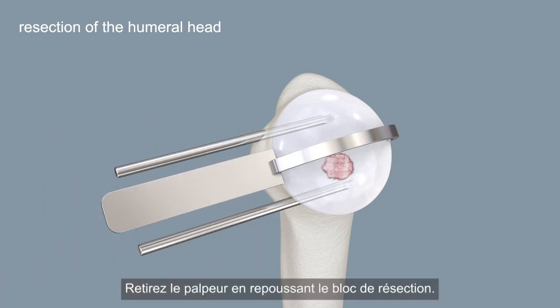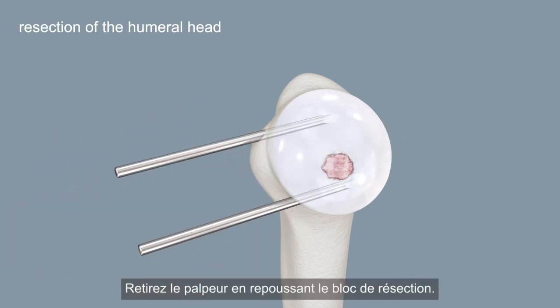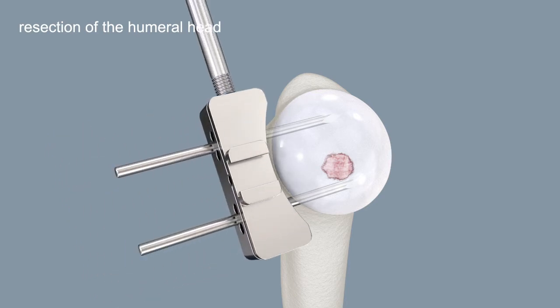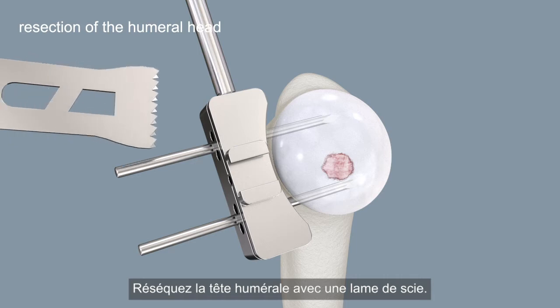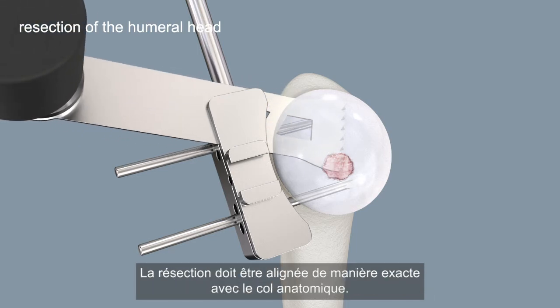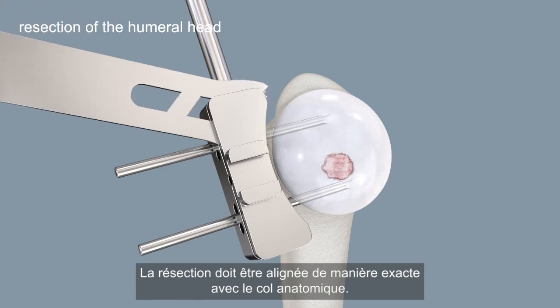Slide the cutting block back to remove the adjustment arm. Resect the humeral head using a saw blade. The resection should precisely correspond to the plane of the anatomical neck.